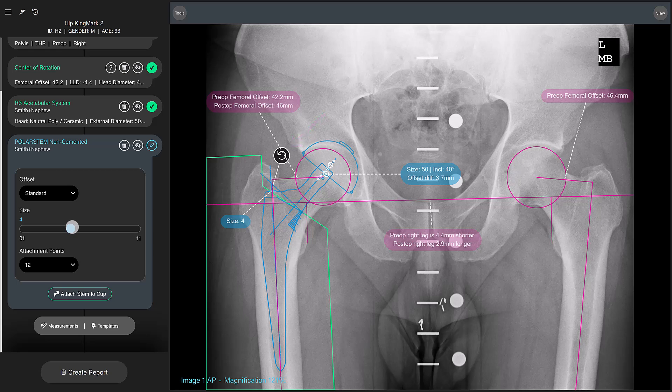As you can see in this example, the preoperative right leg is 4.4 millimeters too short, and the postoperative outcome is 2.9 millimeters longer, which means that the attachment points need fine tuning — namely the attachment points of the head on the stem in the case of a modular stem system like the POLARSTEM.